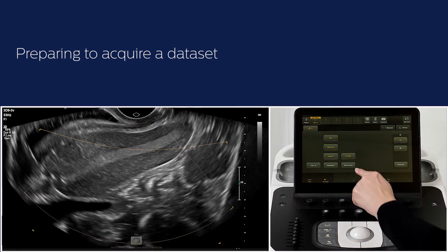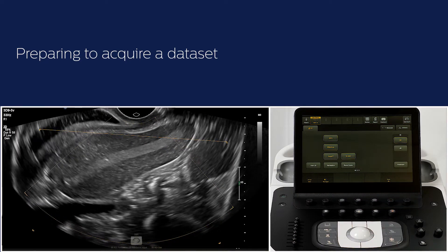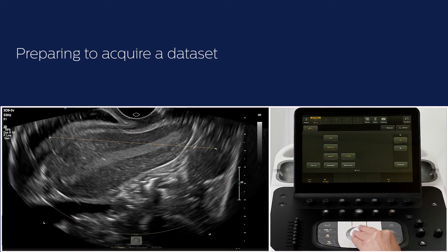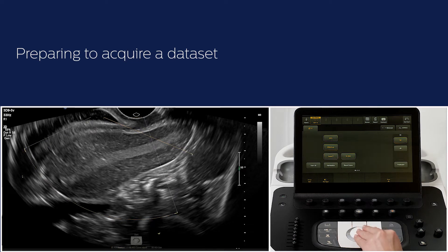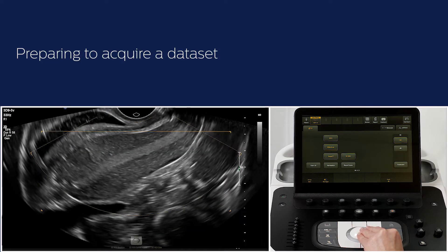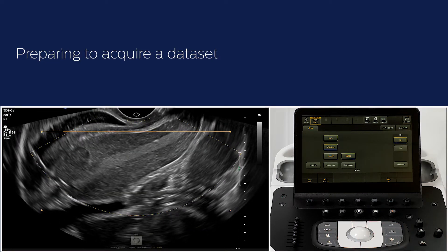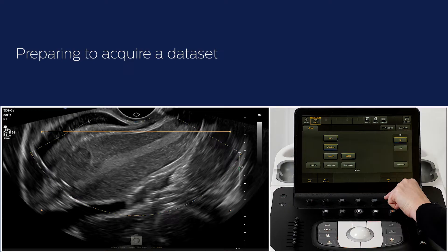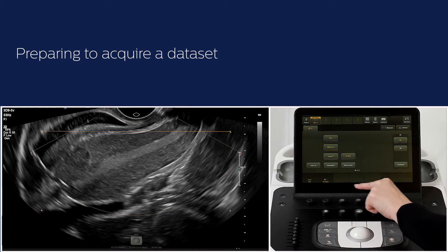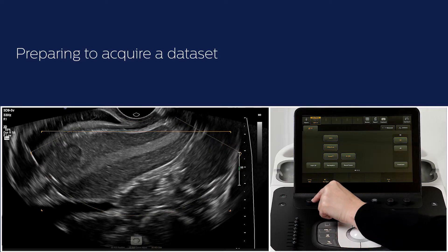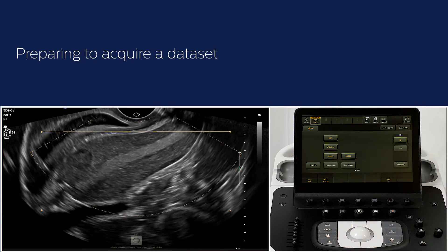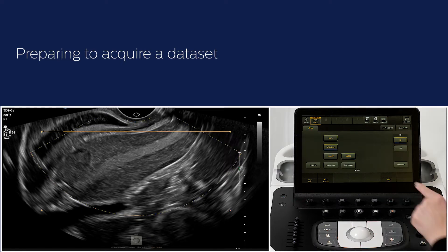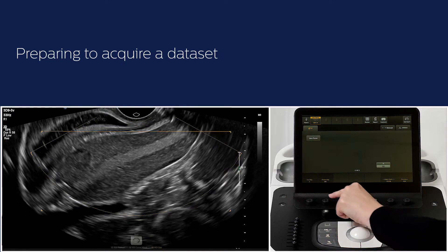Press Reset Curve to return the volume view line to a straight line if needed. Make sure to include all anatomy needed in the ROI box. Further settings can be changed to increase the resolution of the 3D data set. Adjust the angle if a bigger or smaller sweep is needed. The 2D Opt can be changed to Res; a Gen or Pen setting is also available. On the second page of the touch screen, changes can be made to Chroma Map and/or the Gray Map.